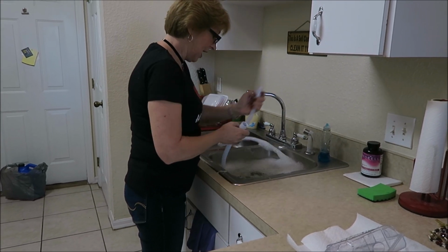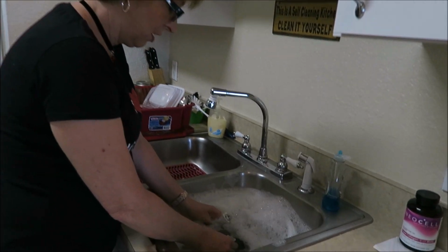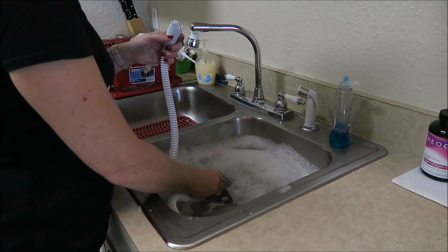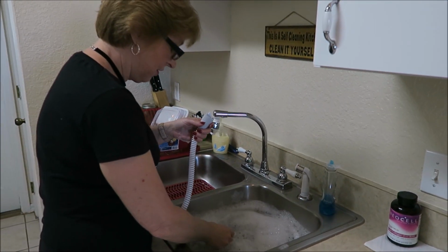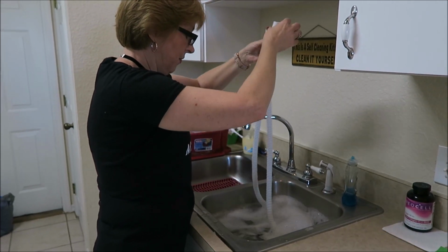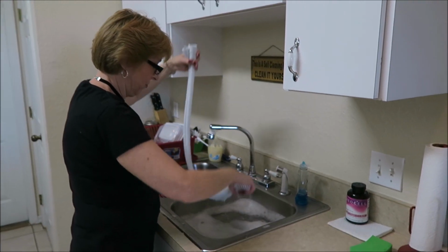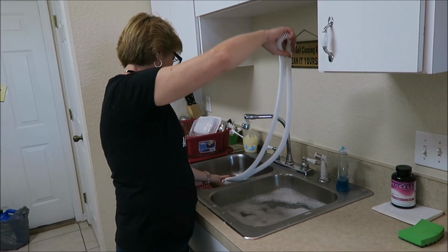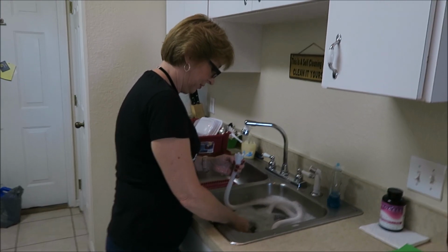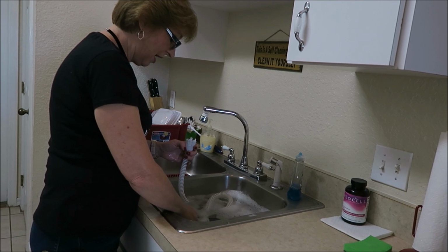Gotta get this crazy thing in the water. So this is what I do. I take both sides, a little bit on this side. I try not to get the connectors wet. You can feel the water as the hose gets heavy. All right, my hose is full. And I dump it out. And I do it again. You can hear it gurgle.